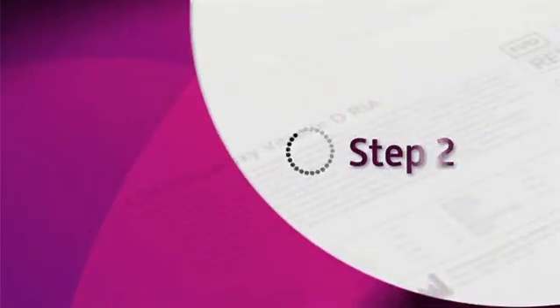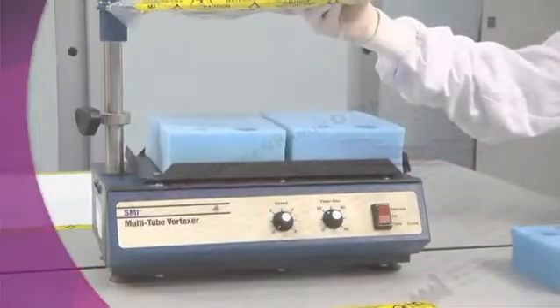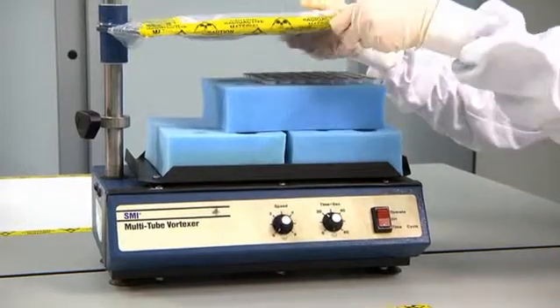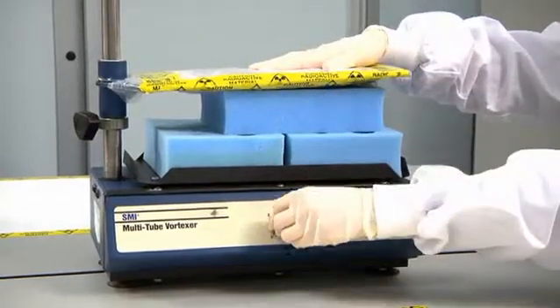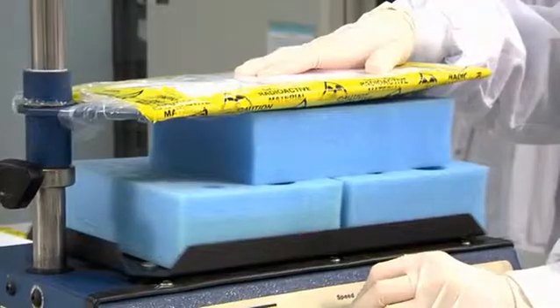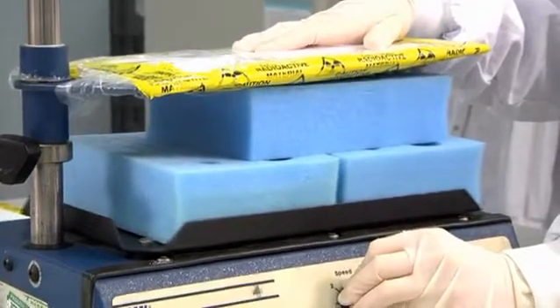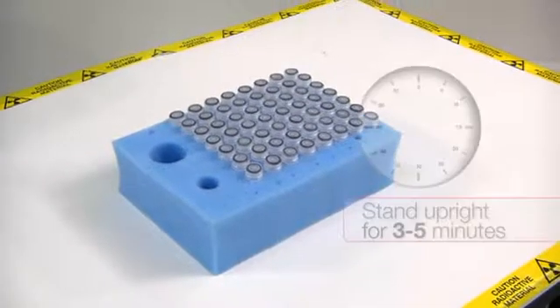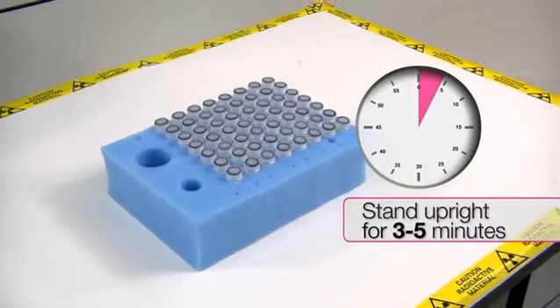Step 2: Vortex immunocapsules and allow the solid phase to settle. Stand immunocapsules upright in the foam rack for 3 to 5 minutes.